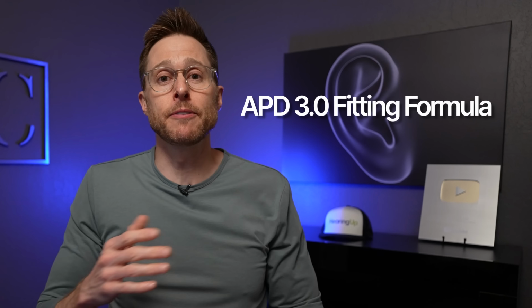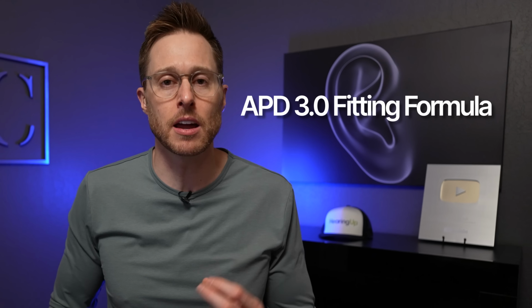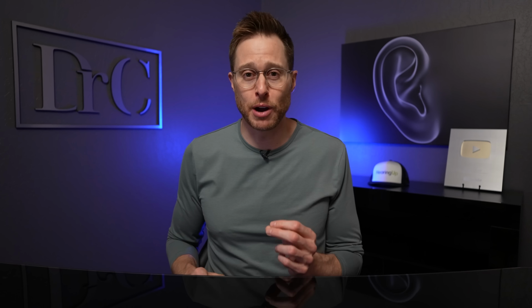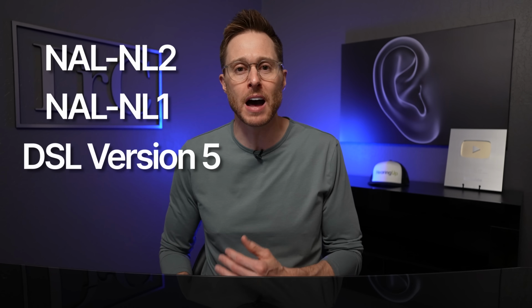Apparently, the new Adaptive Phonak Digital 3.0 fitting formula leads to some pretty high satisfaction rates on the initial fit at 93% satisfaction. However, I highly recommend that you get your hearing aid programming verified using real ear measurement to either a NAL-NL2, NAL-NL1, or DSL version 5 validated prescriptive formula. That is, if you actually want your hearing aids to perform their best in quiet and in background noise.